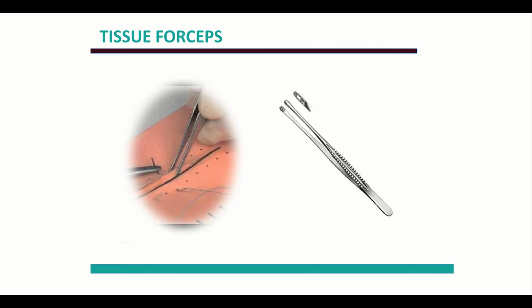Okay, some tissue forceps. They're like cotton pliers, but they're made specifically to hold the tissues. You can see little buttons on the end here. They'll hold the tissues tight for you while you are placing a suture. And again, placing sutures is not you. I'm using the collective word you, meaning your doctor is going to use the tissue forceps and hemostat with our needle on it to pull the suture through the contact and then create a knot here to close it up.